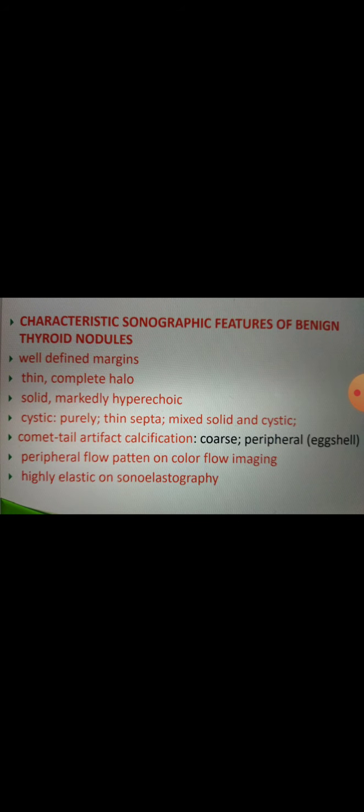Okay, now we will talk about the sonographic features of benign thyroid nodules, and we will also talk about the sonographic characteristics of the malignant thyroid nodules as well.